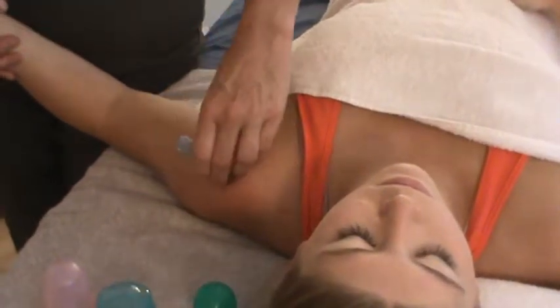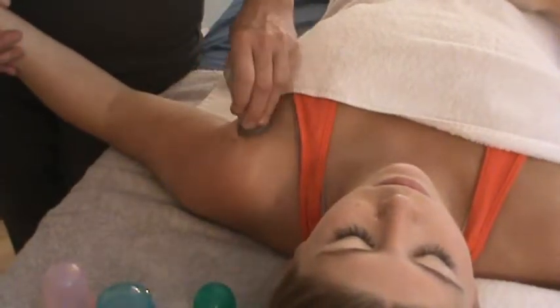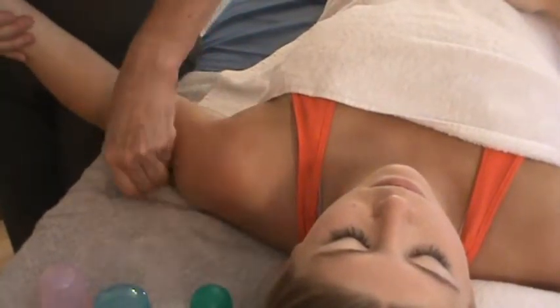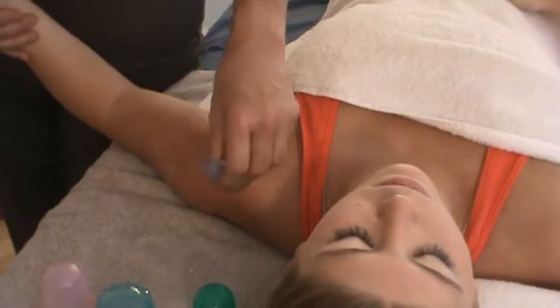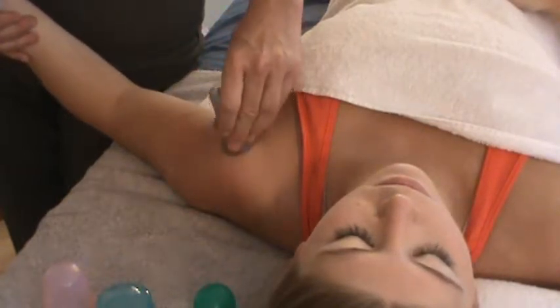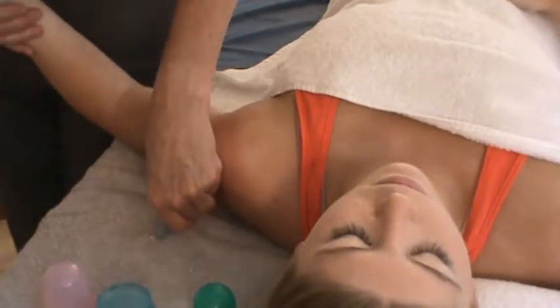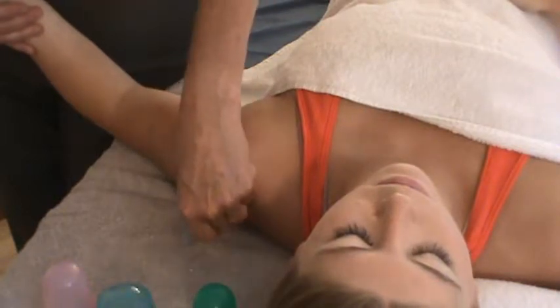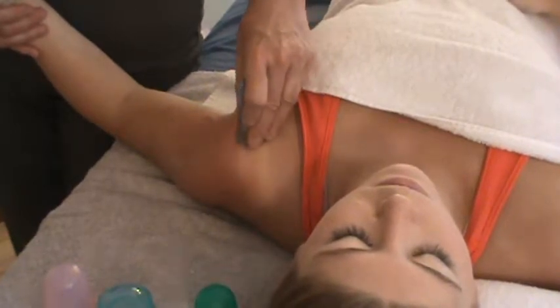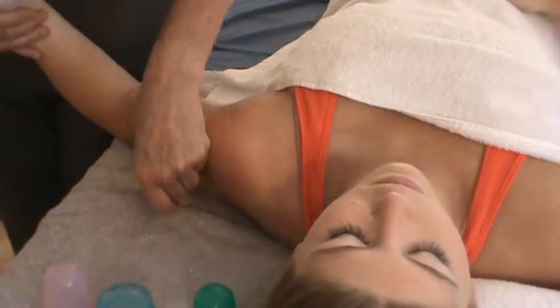And I'll follow individual muscles, so I'm working the deltoid first, as you may have noticed, going origin into insertion. You can see the nice pink effect that we're getting from increasing circulation because it's bringing blood flow to the surface. When you go over a drier area or a bony prominence, the cup tends to slip off. So simply compress, place again, and automatically get that nice vacuum effect. And don't stay on any one area for much longer, only enough time to get that little erythema response, get that circulation. So it's an excellent warm-up before you're doing your deeper myofascial work, joint mobilization, or whatever is necessary or indicated across the stiff shoulder.